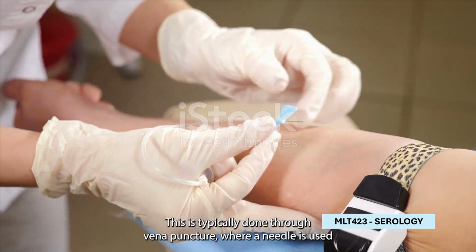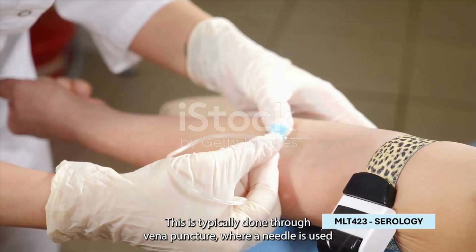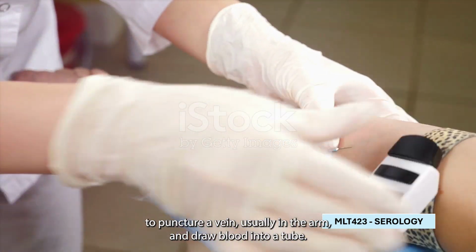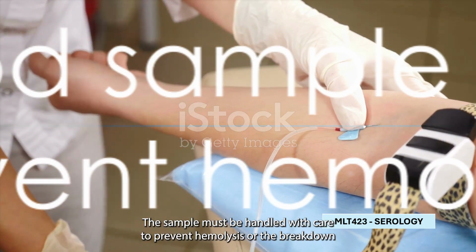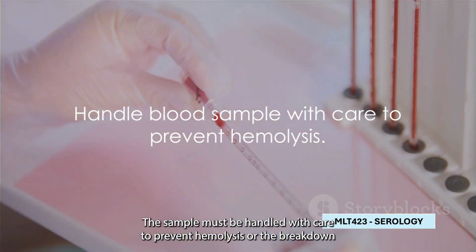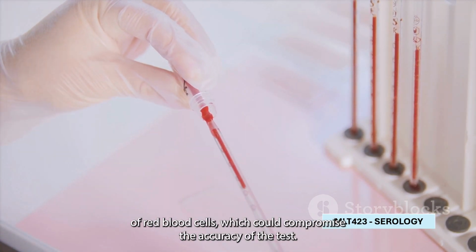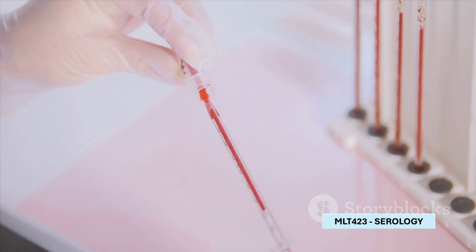This is typically done through venipuncture, where a needle is used to puncture a vein, usually in the arm, and draw blood into a tube. The sample must be handled with care to prevent hemolysis, or the breakdown of red blood cells, which could compromise the accuracy of the test.